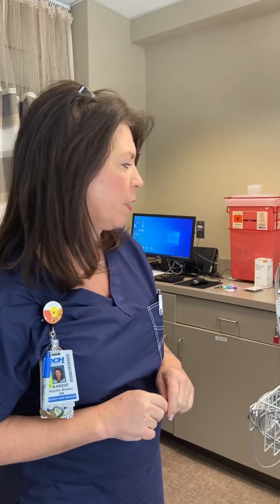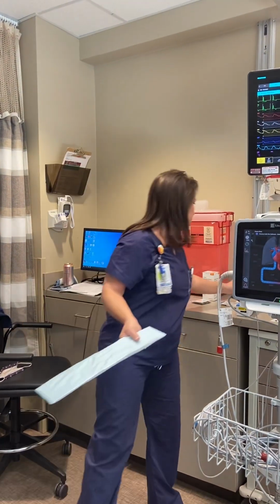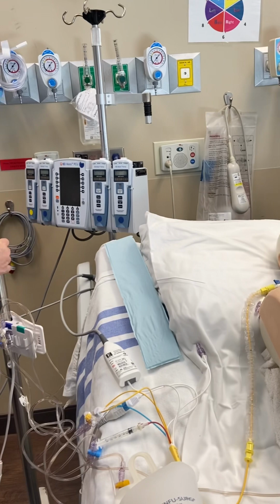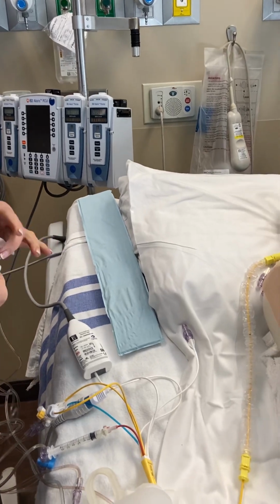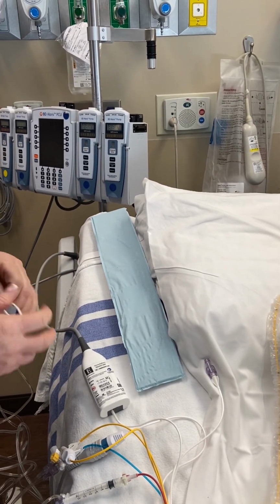Today we're going to discuss setting up a Swan on a patient that just arrived from open heart surgery, okay? You should have an arm board, and you should also have your 2-inch silk tape. You will tape your op mod to the blue side of the board. And your secondary person is doing this for you while you are getting a report from the OR.